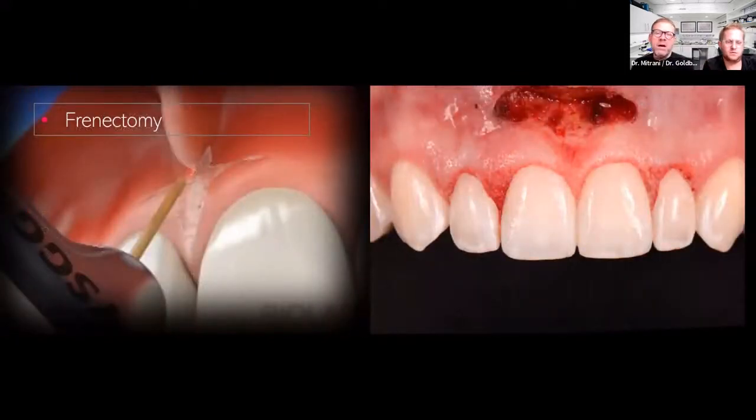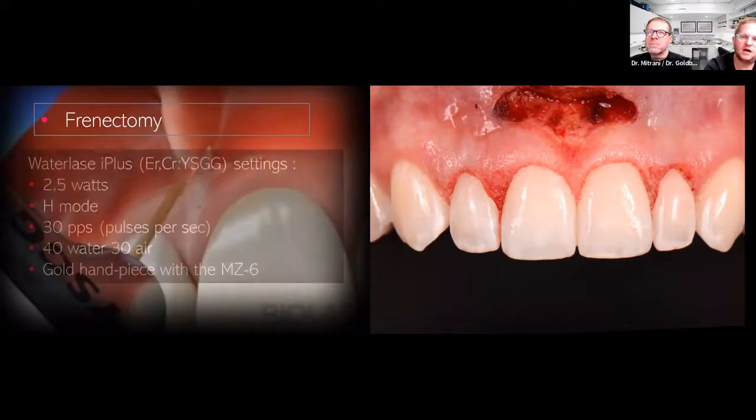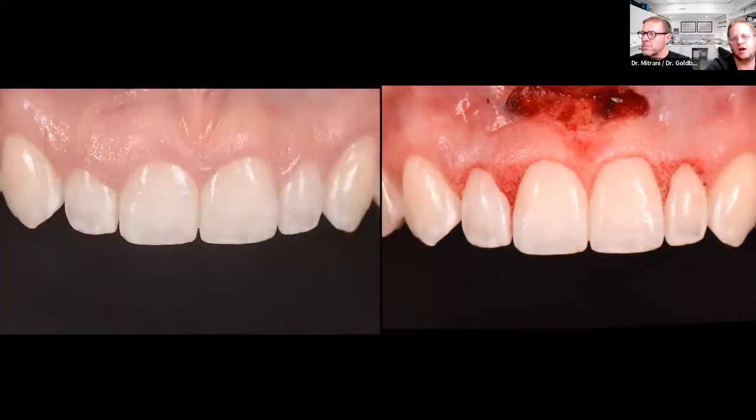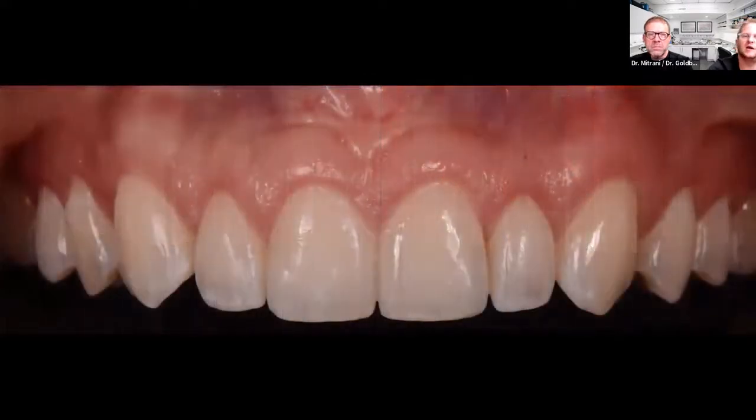And then just as he finalized doing both the soft tissue and bone recontouring, then he starts working on the frenectomy. Yeah, so we do what we showed in the last case. So very similar technique for frenectomy. And again, here are the parameters that we use for frenectomy. And as you can see, we change a little bit based on if we're using soft tissue or hard tissue. And this is the picture right after we finish both procedures. And you can see how it heals after a couple of weeks.